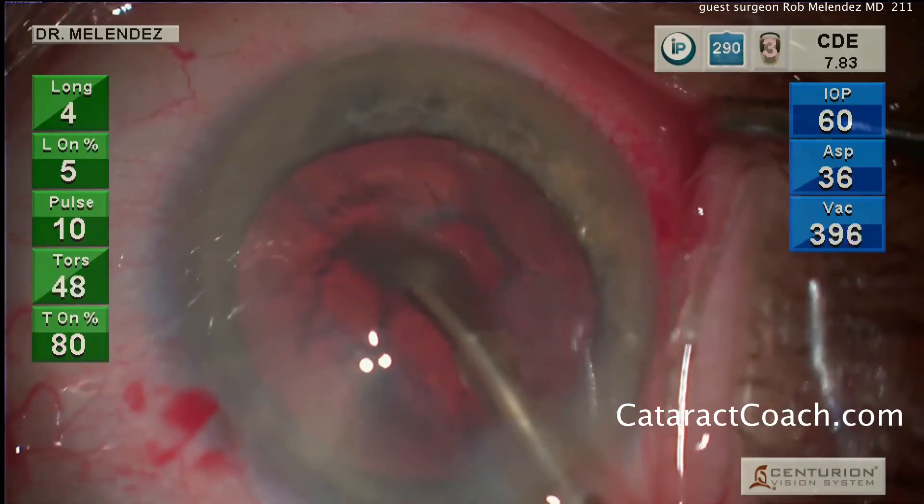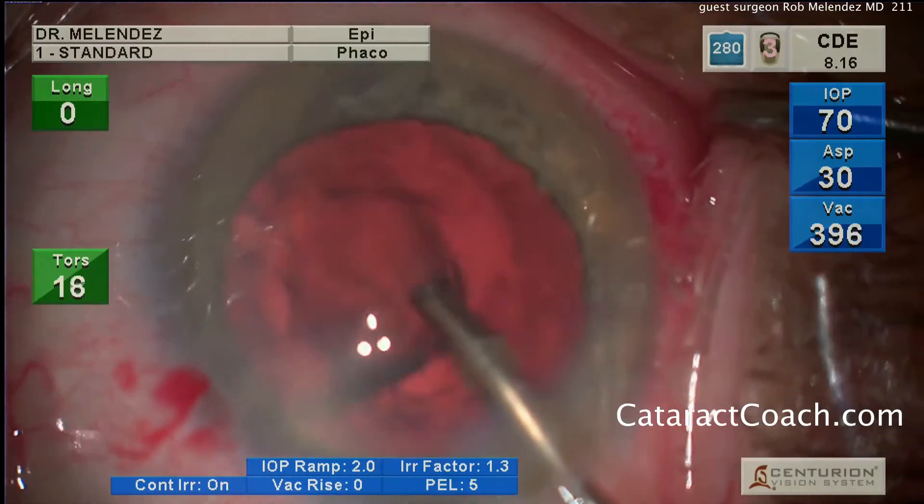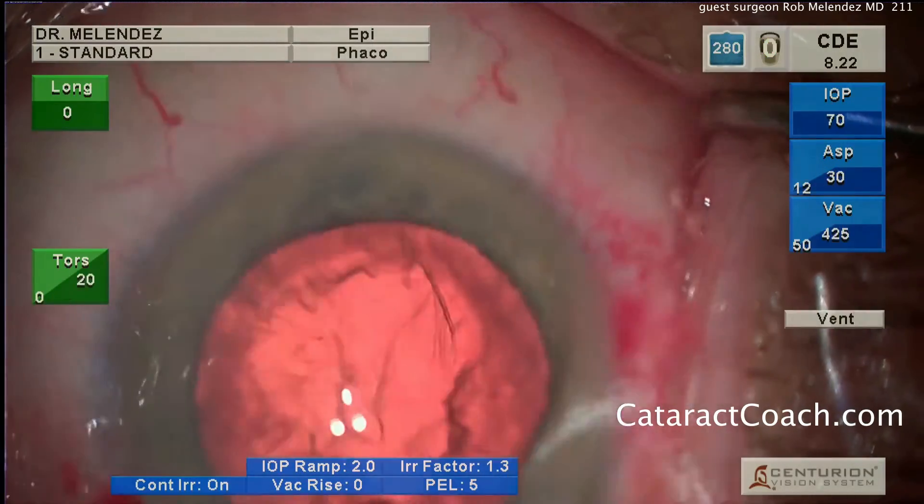The cataract moves quite easily — that looks fantastic. Now here comes the epinuclear shell, and that's aspirated out as well. That looks clean.